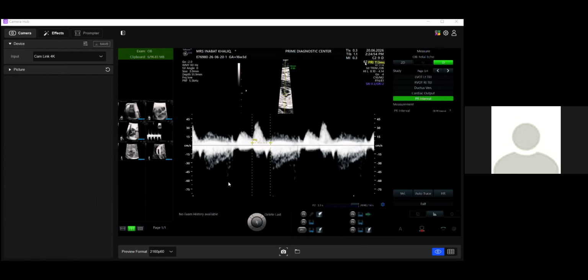And then in case there is TR after 24, 25 weeks of gestation, and you get some echogenicity in the heart, then we know the anti-Ro, anti-La antibodies do not only affect the AV node, they affect the myocardium as well, and they also affect the sinus node partly, very small.